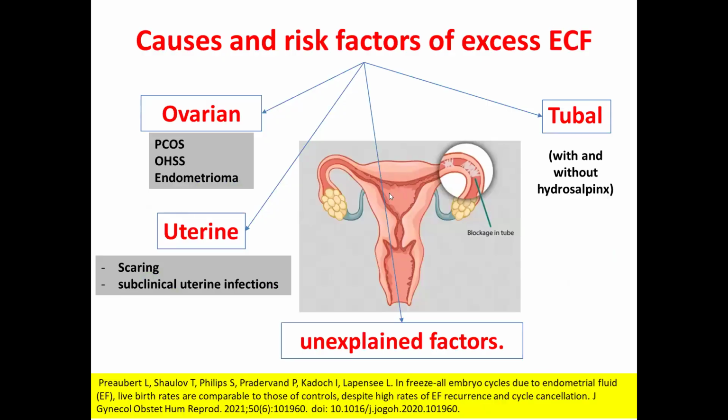What is the cause of accumulation of fluid inside the endometrial cavity more than 3.5 millimeter to be seen by ultrasound in our patients? The main cause may be uterine. Think uterus, always think uterus is the cause of accumulation of fluid. Maybe cervical stenosis, maybe adhesions in the cervix, maybe cesarean section, which is the lower part of the uterus, maybe myomectomy, maybe hysteroscopic adhesiolysis, or any intrauterine adhesions. So think uterus as a cause of accumulation of this fluid.